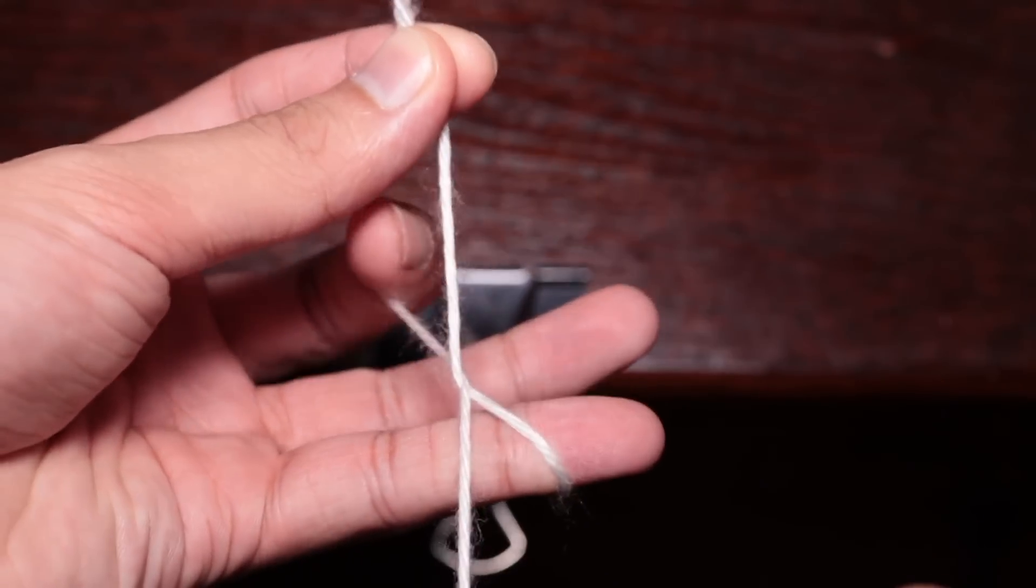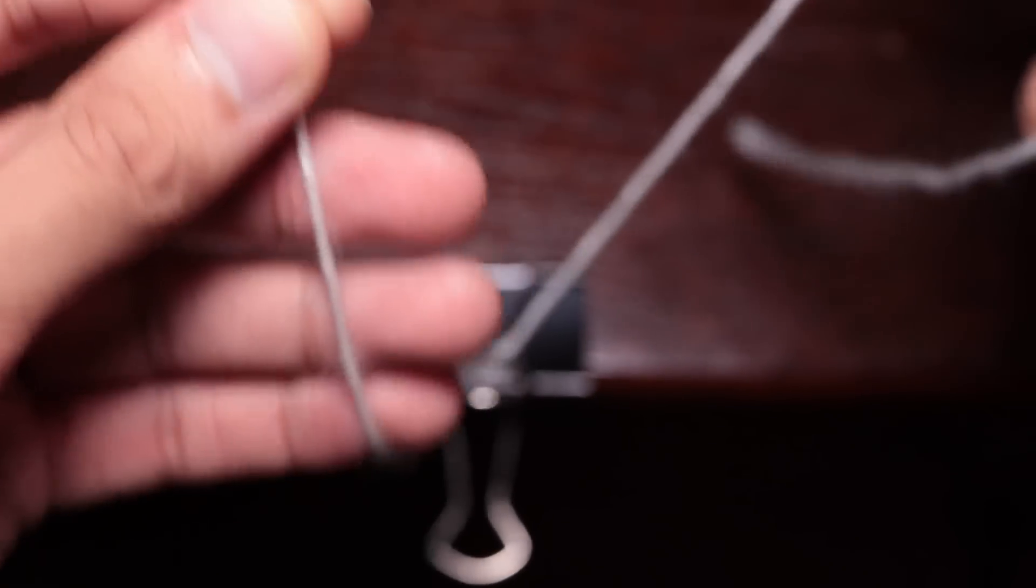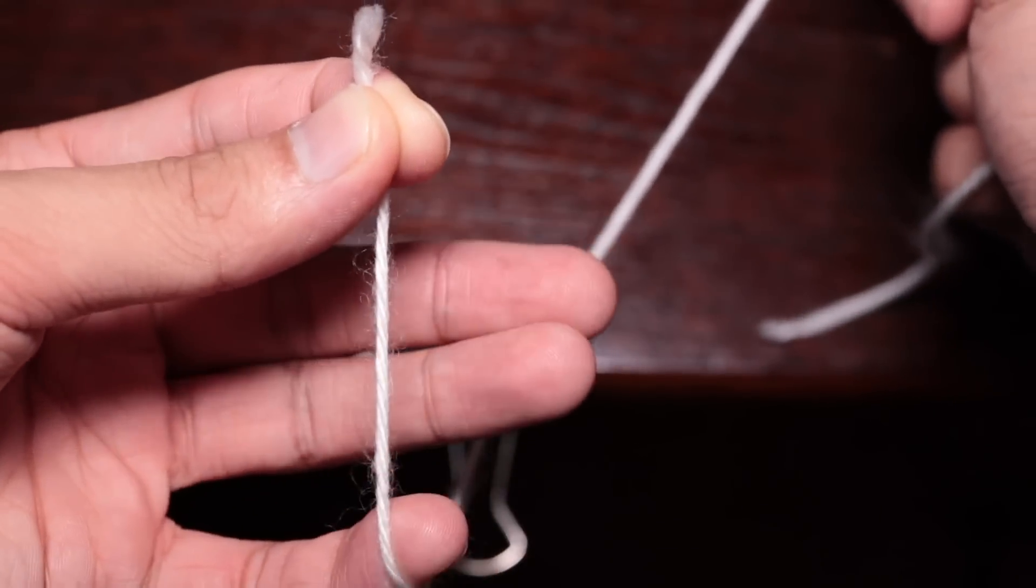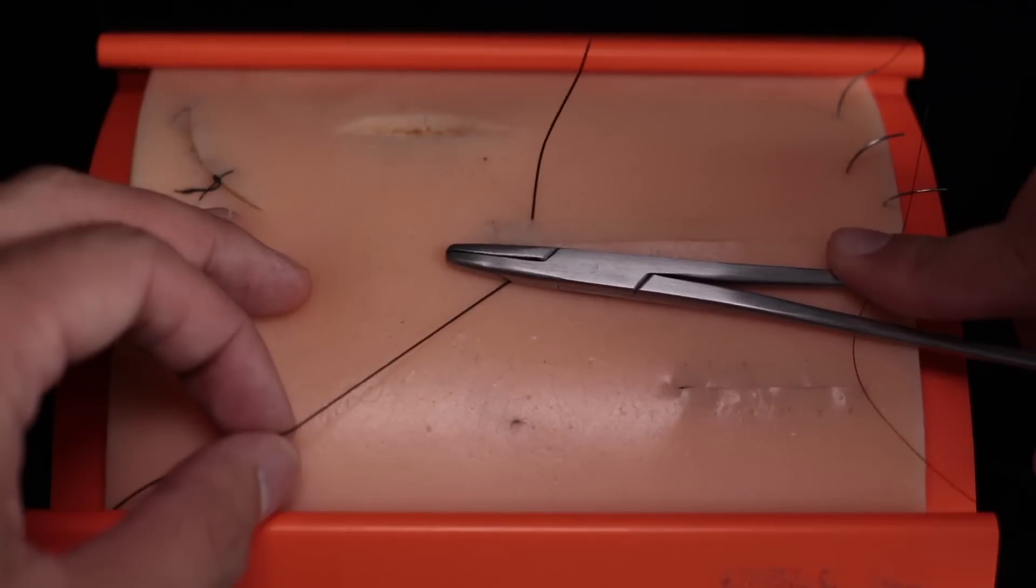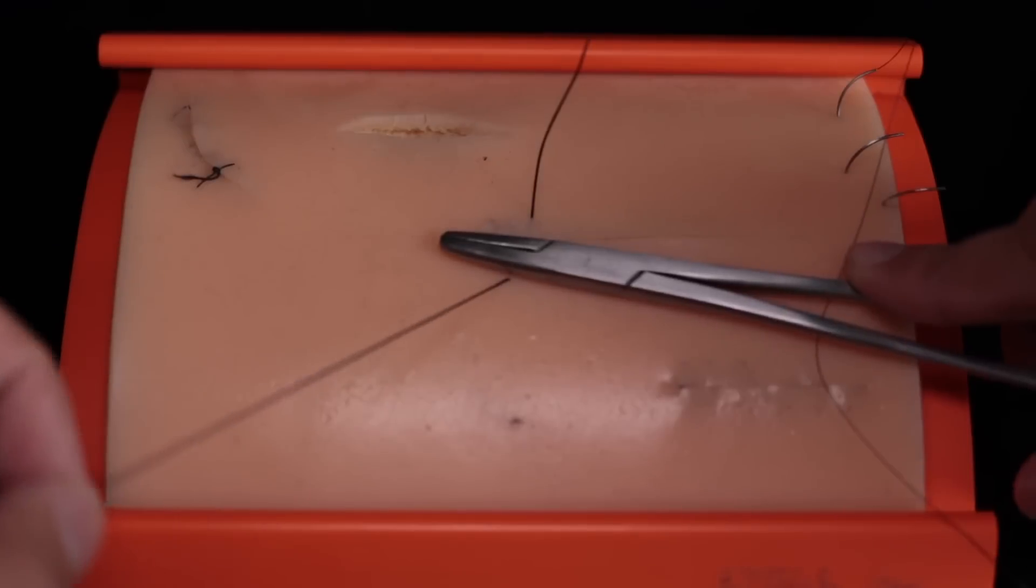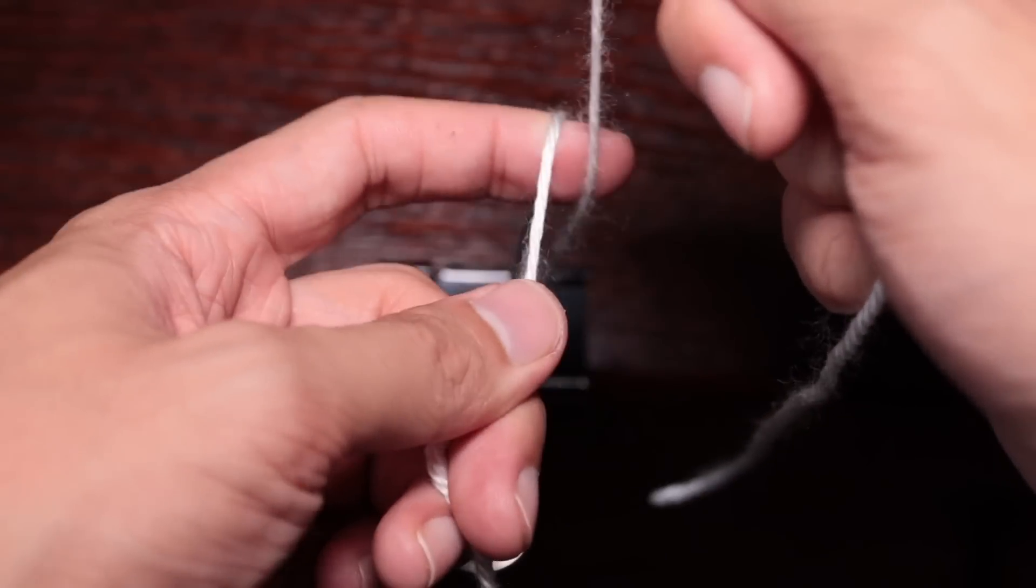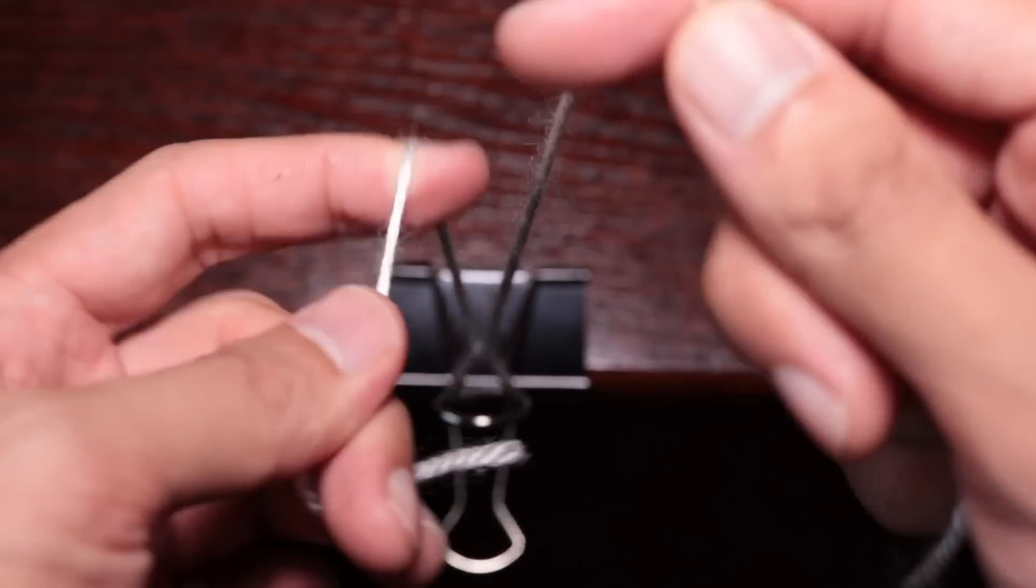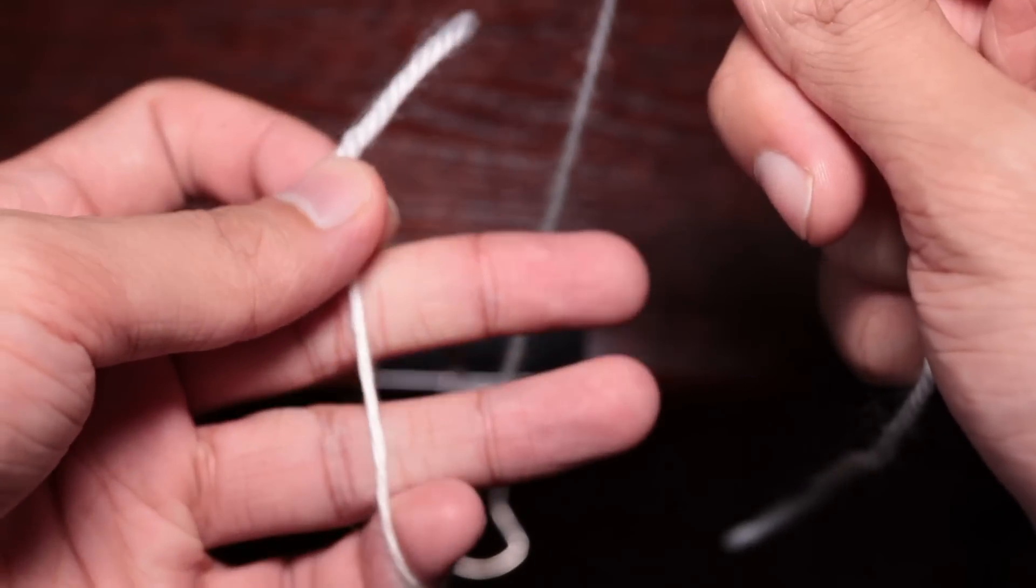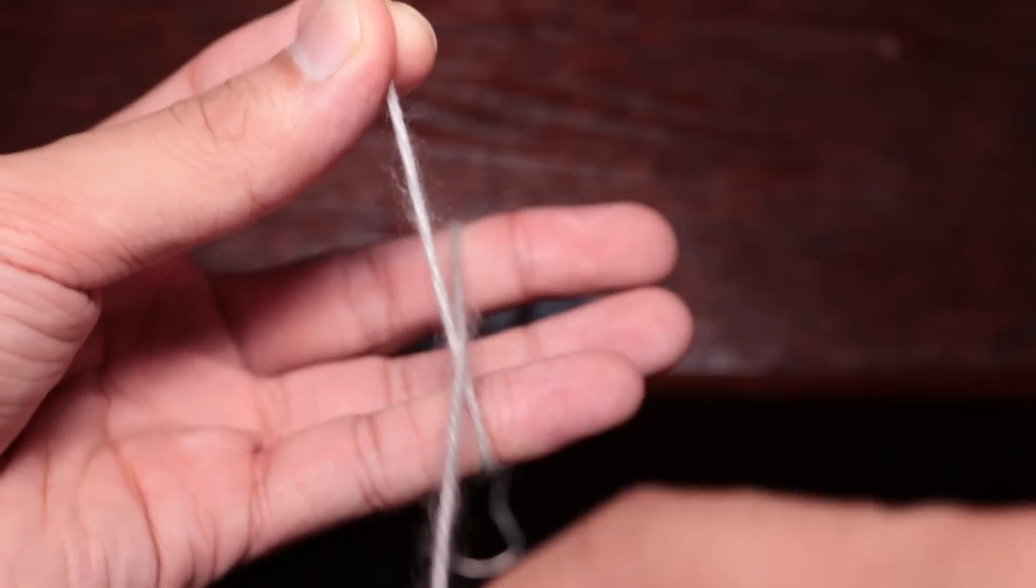There is an easy way to remember which knot you're supposed to do between the finger knot and the index finger knot, and that's to view your fingers as an instrument in the instrument tie. As you can remember, you're putting the instrument between the two strings without any crossing over. If you were to do your index finger there it would cross, but if you were to put your middle finger and your ring finger in the middle it's kind of like the instrument tie. I know it sounds confusing but do a few of them and you'll understand that this works.